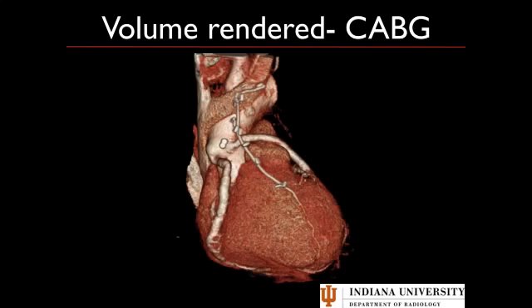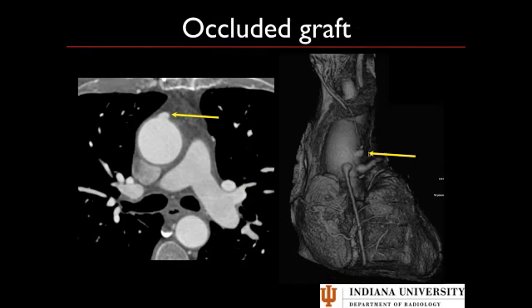Volume rendered images are most valuable in coronary artery bypass graft cases, because they provide an easy lay of the land. You can see the LIMA graft, clips along side branches, and two aortic grafts. You may not be able to tell whether they're saphenous vein or radial artery grafts, but it nicely shows how many grafts you have and can even reveal an occluded graft — such as a nubbin of an occluded graft. Otherwise, volume rendered images have no real value and should not be used to look for stenosis.